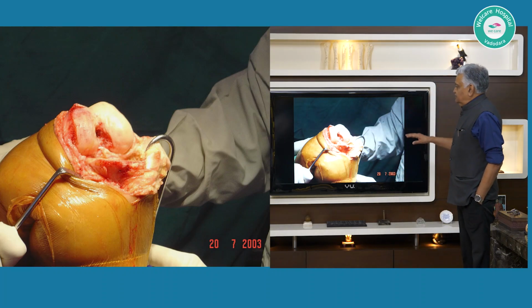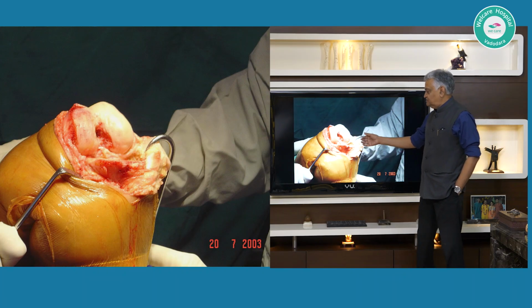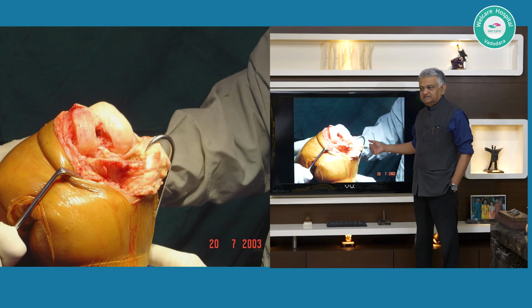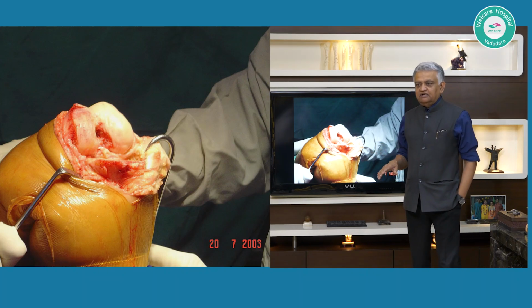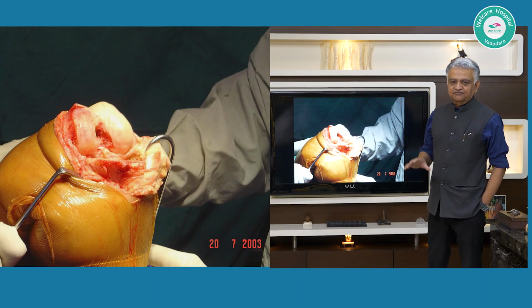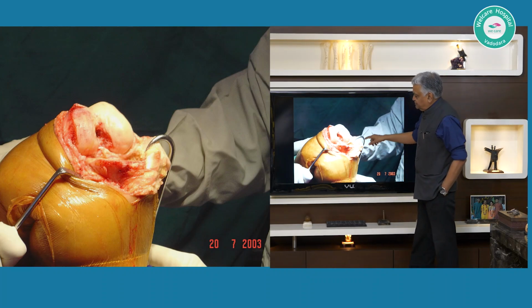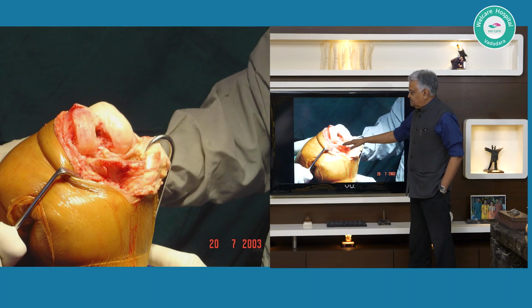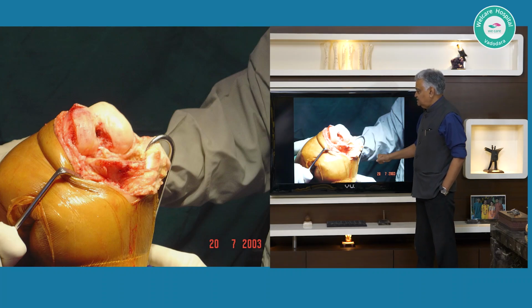All right. So we did our incisions, we did our exposures, we brought the tibia subluxated or dislocated from underneath the femur, and we have taken our proximal tibial cut. Today our lecture will cover the cuts that are relevant to the femur side of the entire equation. So we will start off from here, and as you can see, now the tibia is cut. This cut surface gives you a reference point for the further cuts that you will make on the femur.